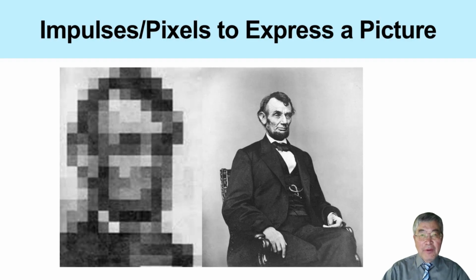This example reminds us that a digital image is not stored as a continuous function. It is stored as a finite set of numbers, one number for each pixel. Therefore, when we reconstruct a CT image, we are essentially trying to estimate these unknown pixel or voxel values from X-ray projection measurements. This pixel-based representation naturally leads us to an algebraic view of CT reconstruction.